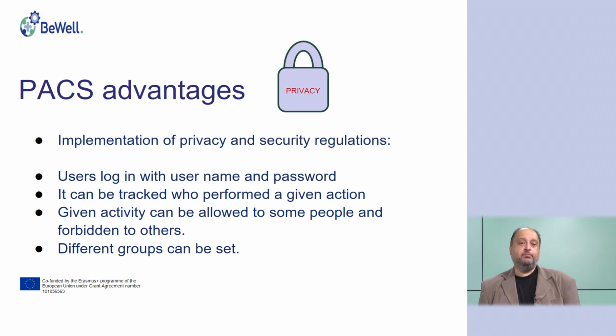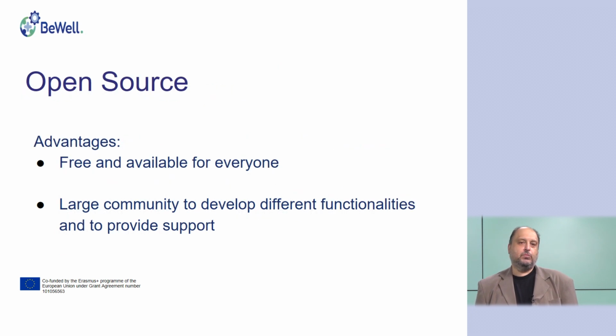Some actions can be allowed only for some people and forbidden for others. For example, if a physician sent a patient, this referring physician will have the right to see the patient's exam, but not the exams of other patients not sent by this physician. And some group rights can be set, of course, to facilitate the work.